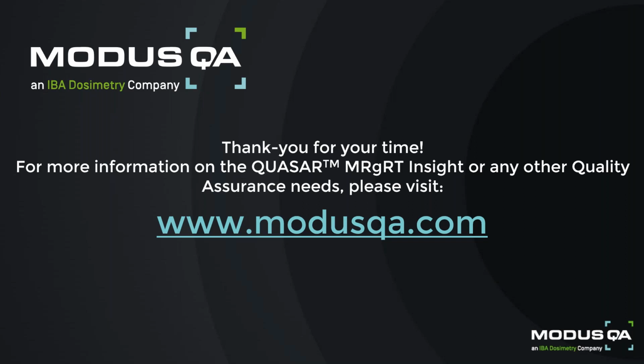All right, well, thank you for the question. While the Insight Phantom can be used for MR simulators, its true versatility really lies in the optional accessories that we touched on briefly before. So the ion chamber holders, the 2D dosimetry film cassettes, the laser alignment targets, the MRMV targets, and all the others. Those will allow you to convert the Insight Phantom from just your day-to-day image quality monitoring to a full-blown end-to-end treatment planning and delivery QA device on your actual MR Linac.